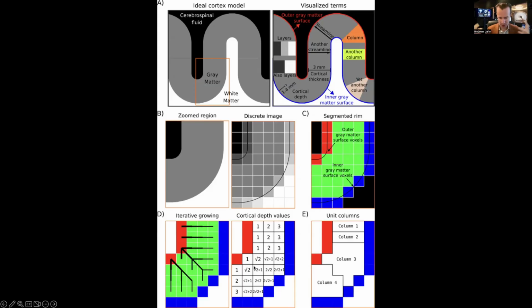And again, saying that these are 1 millimeter isotropic voxels, through the Pythagorean theorem, which I haven't used in a while, but glad I learned it in high school, that means that this hypotenuse, this diagonal bisecting this square, is going to be square root of 2. So the overall distance is 1 plus square root of 2. And if you want to make it compact, 2 times square root of 2, because these are two diagonals, plus 1.